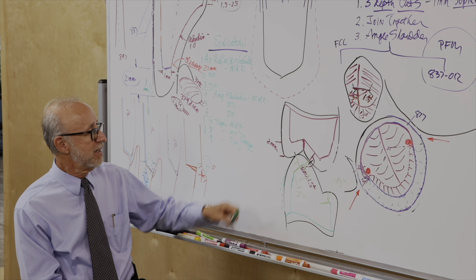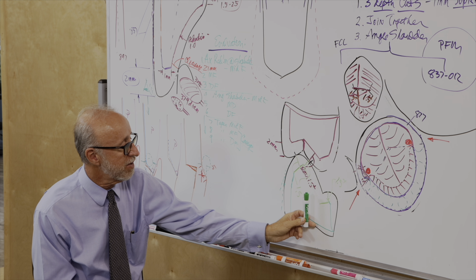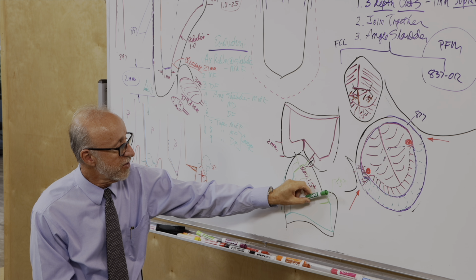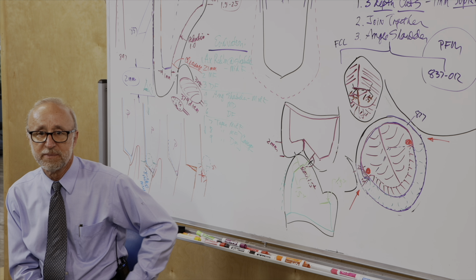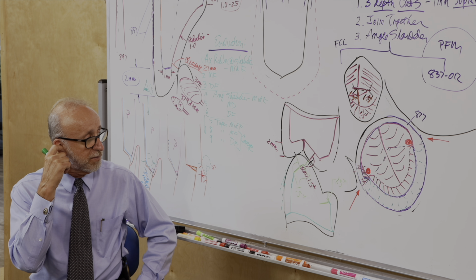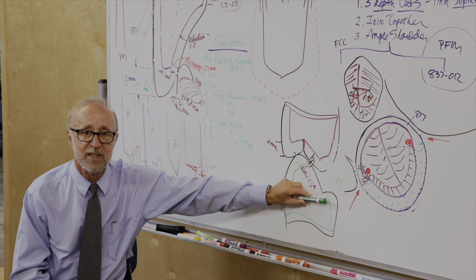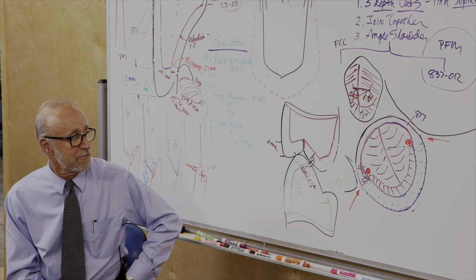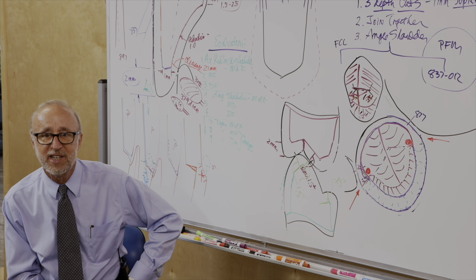Well, A, B, C. So A plane like this, B plane, we get some clearance up here, but we're coming way down here. The central groove is way shifted lingually, isn't it? So just follow where the central groove was, and then just get plenty of reduction on that little tiny lingual cusp. The clearance is meaningless on the lingual cusp. Yeah. So it's like just preparing similar to a canine maybe? Well, yeah, as long as you know how much you're reducing that cusp, then you should be okay. Yeah, we don't have a particular height that I want to look at right there. But yeah, a little bit more related to that. But again, mandibular canine. Yeah.